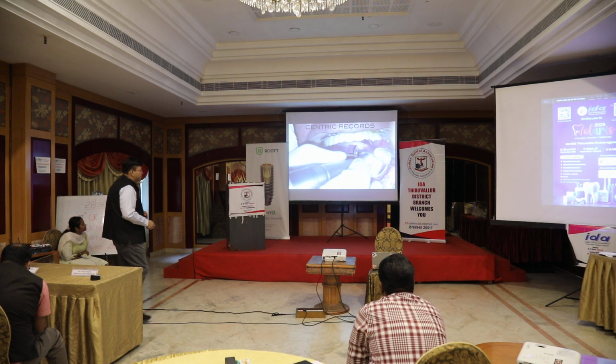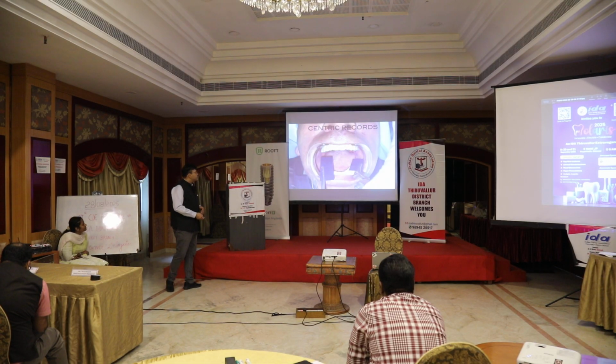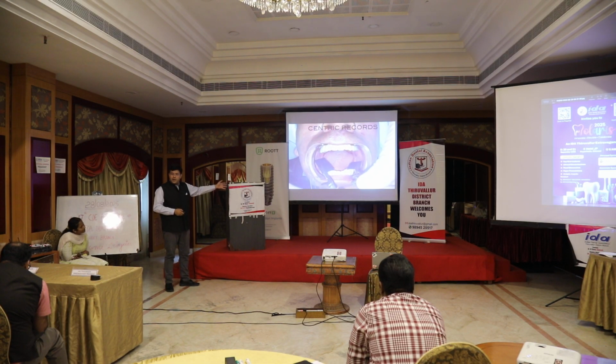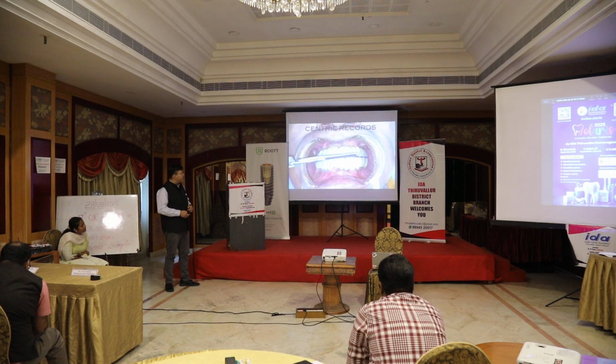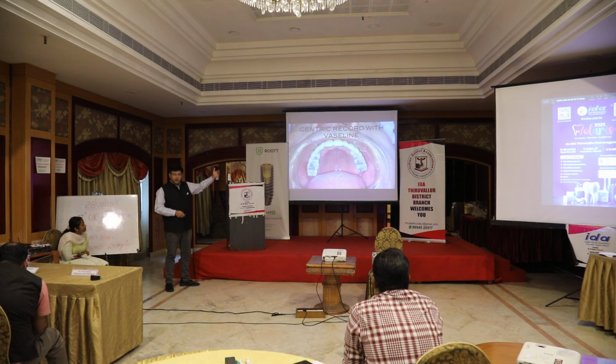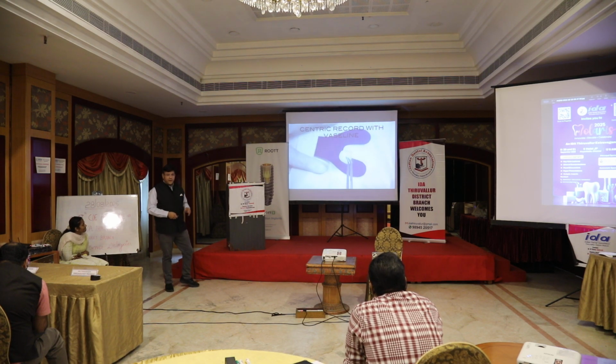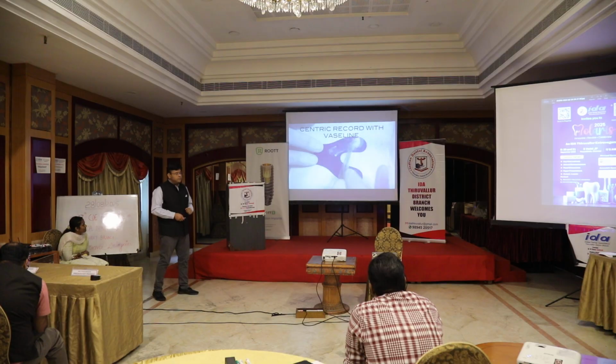So I keep on reducing, again take those centric marks. If you do not have a U-shaped paper, you can use strips on both sides, take markings, take contacts, again centric contacts, keep doing it. We can see slight improvement, we do not have all the contact points. This is how you put Vaseline on, before recording your contact points.